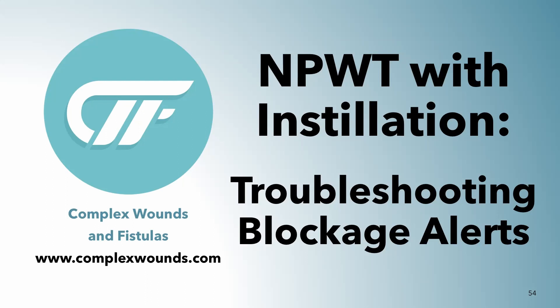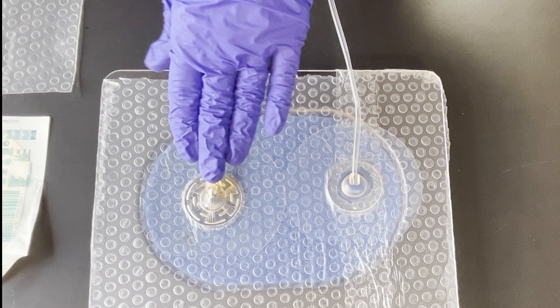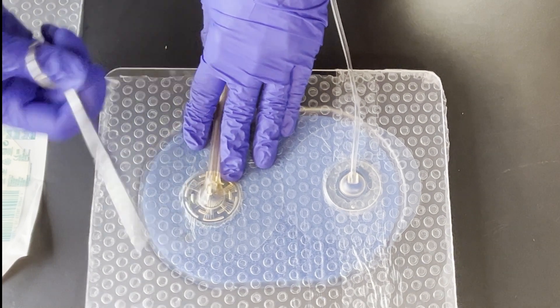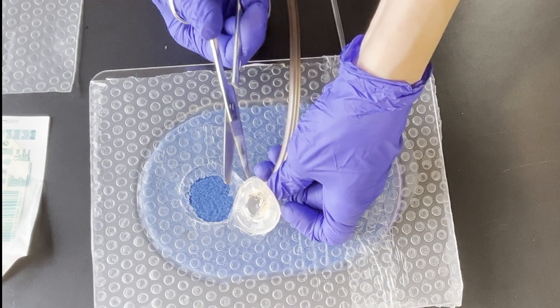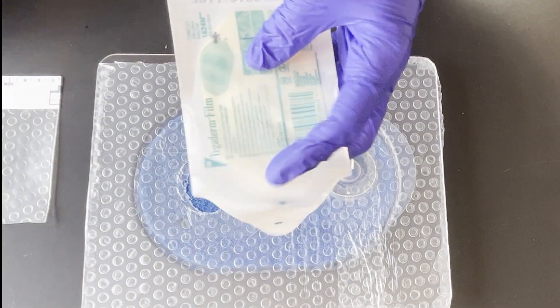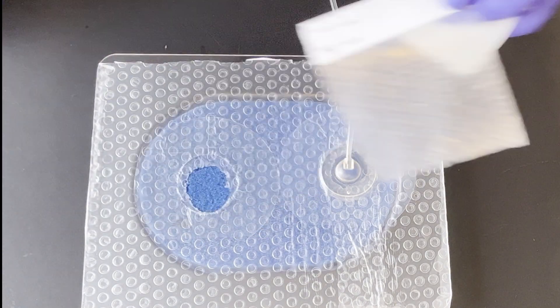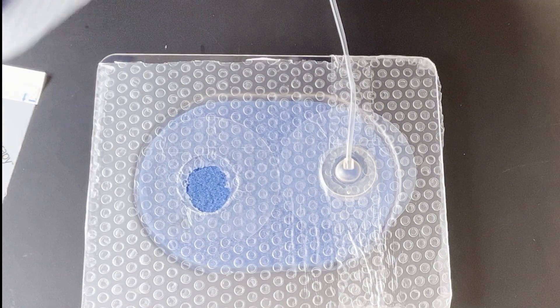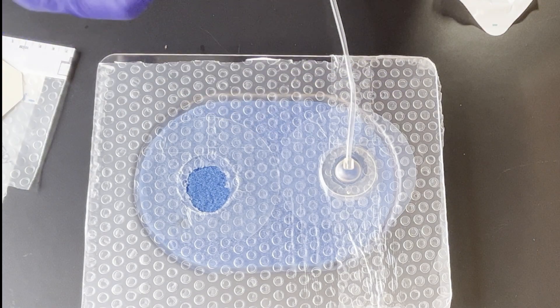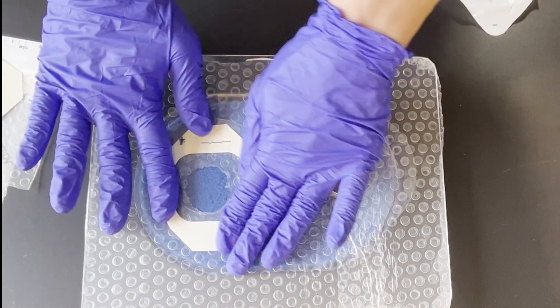I have a video that shows you a technique for handling blockage alarms — the instillation is separate from the negative pressure. So if you have a blockage alarm for your negative pressure system, you simply need to clip the edge of this and peel it off. You can seal it with a Tegaderm film, another piece of drape, or extra drape that's in the room. We're just going to use a little piece of Tegaderm today, so you're just going to seal that up.